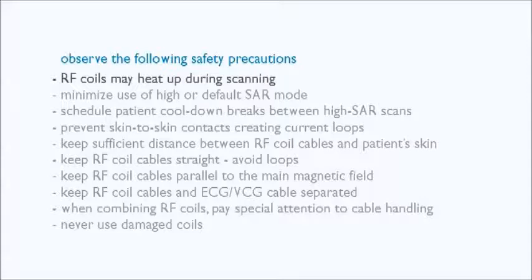Remember that RF coils may heat up during scanning. Minimize the use of high or default SAR mode. Schedule patient cool-down breaks between high SAR scans. Prevent skin-to-skin contacts, creating current loops. Keep sufficient distance between RF coil cables and the patient's skin.